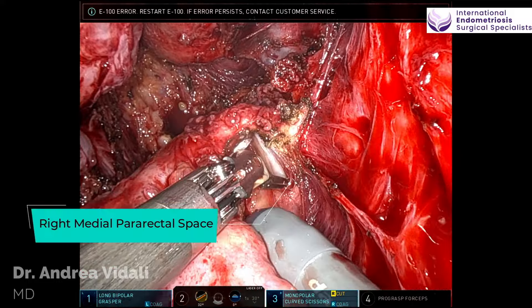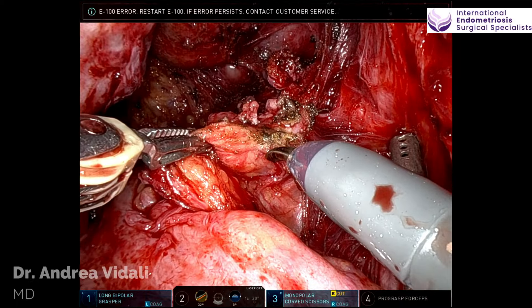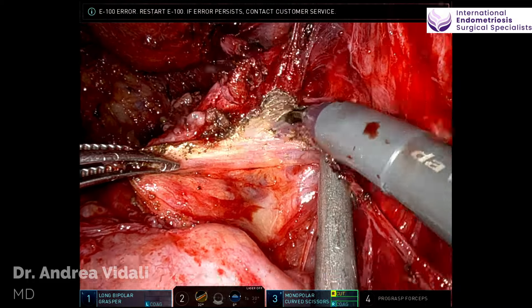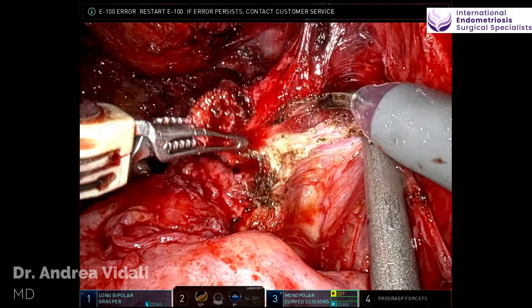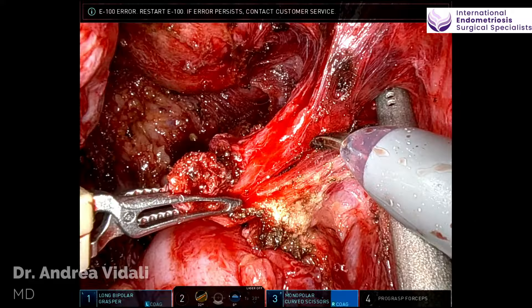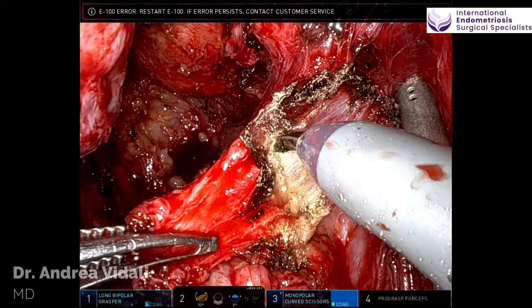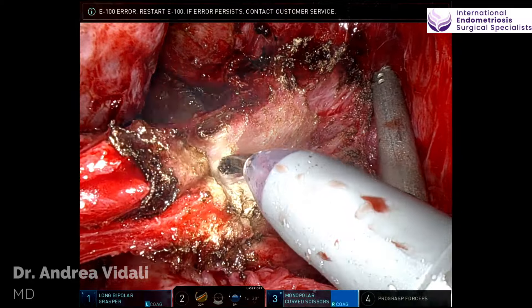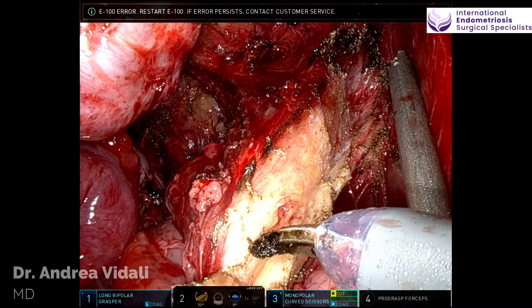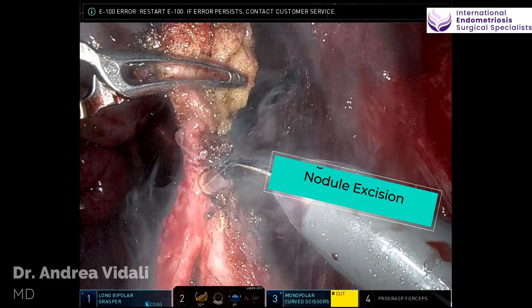Because of this, a patient can exhibit nerve symptoms even if there isn't any direct invasion. But here, clearly, you could see that some of the nerve fibers were clearly distorted. We are both excising disease and restoring normal anatomy. Before starting the operation, I always perform a cystoscopy and inject ICG green in the ureters, which helps facilitate visualization of the ureters. You could see a little bit of additional spill, which is due to the hysteroscopy I also performed.